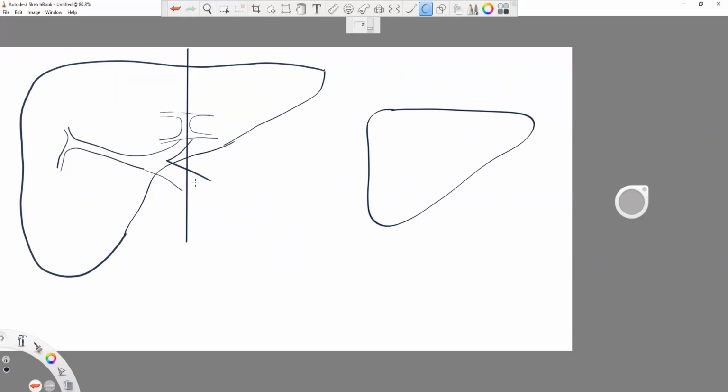If you took a ball and looked at it from the so-called transverse and so-called sagittal, it's going to look identical, because it's perfectly symmetrical. The liver is somewhat symmetrical too, in the sense that on this transverse image, we see the left and the right. On this one, this is trans, and this one over here is sagittal.